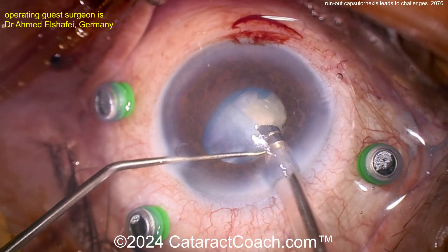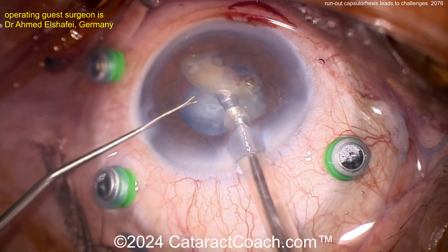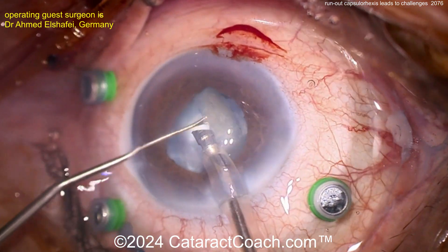You still don't know what's going on with that capsule back there and whether or not you'll be able to get some reasonable IOL support — are you going to put the lens in the bag or not? So let's get that last piece of nucleus up. The pupil's coming down too, to make your life more challenging. A lot of challenges.